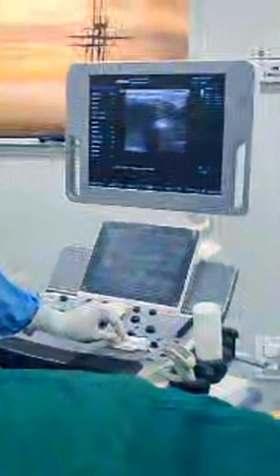So this is a normal thyroid. These are the carotid vessels on the right side. In the left side, when I'm moving the probe, you can appreciate these are the abnormal tissues, which are the target for us. And you can appreciate this is fluid around the thyroid, such that no pain will be there, and heat damage will not occur to the rest of the structures. So we are going to start this now.